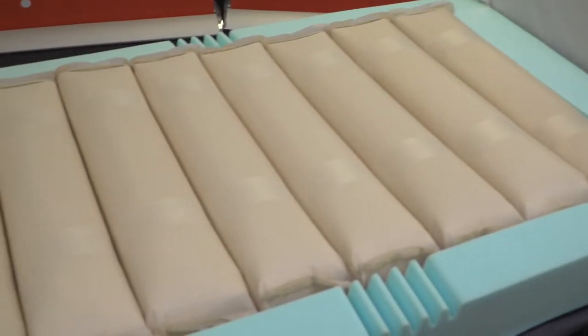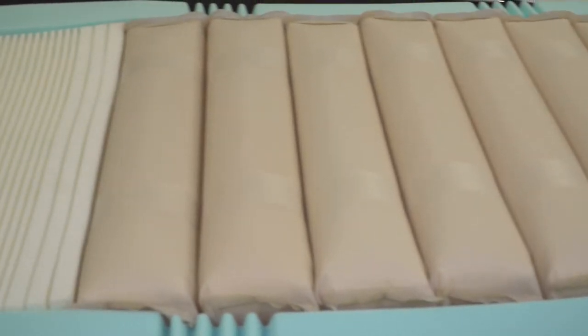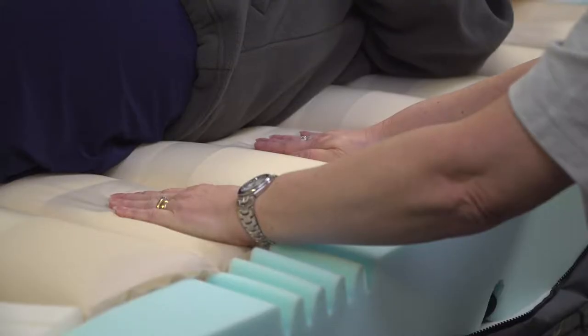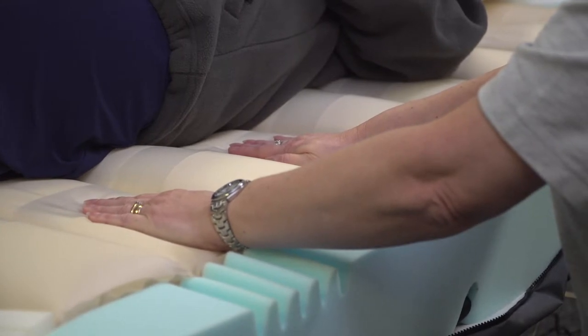Cell construction consists of 9 cells filled with deluxe foam. The cells alternate in an 11 and a half minute cycle. One set of alternate cells deflates for 5 minutes, then starts to inflate again to equalise with the other set of alternate cells for a minute and a half, before the second set deflates for 5 minutes, completing the 11 and a half minute cycle.